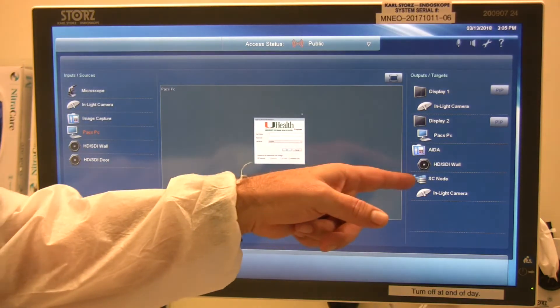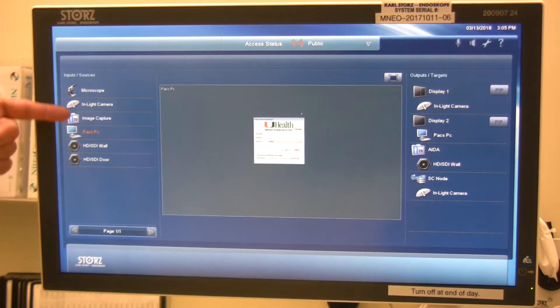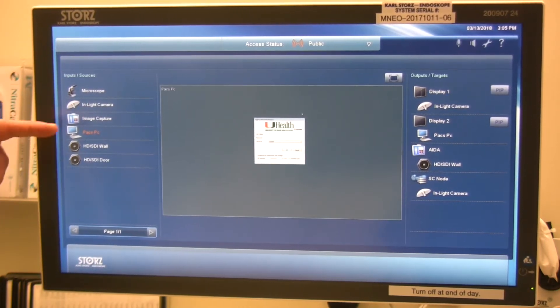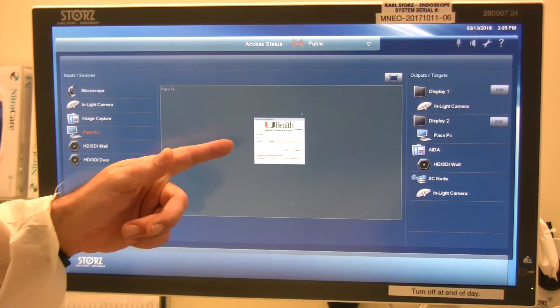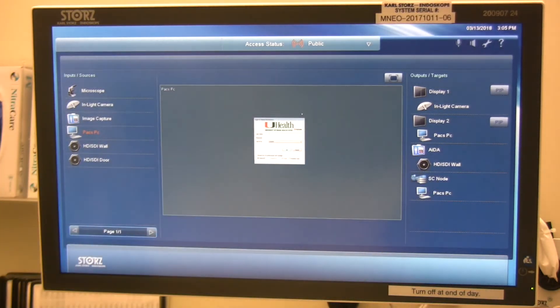The last destination is the SC node, which stands for Stream Connect node — that is for live streaming. Very much like the AIDA HD Connect, you would select the video source you want to live stream, select it, get a preview, and route it to the SC node for live streaming.